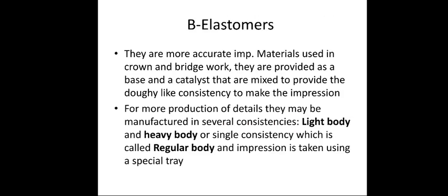For fixed crowns and bridges, we need materials that are dimensionally stable and tear resistant and give precise details and representation of the fine details of the crown preparation, the finish line, and the adjacent structures.